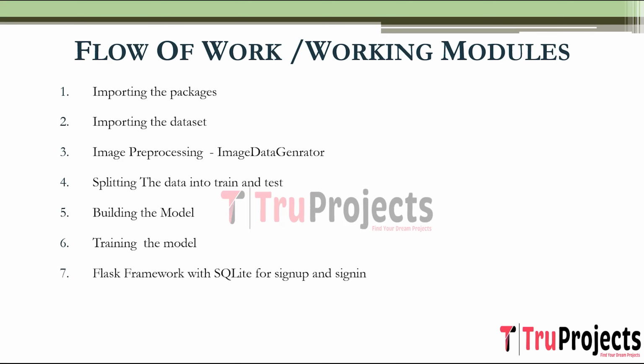The next step is Flask framework with SQLite for sign up and sign in. Flask, a lightweight web framework for Python, is integrated with SQLite, which is a relational database management system, to implement user sign up and sign in functionalities. This allows users to create accounts and authenticate themselves before accessing the prediction system.